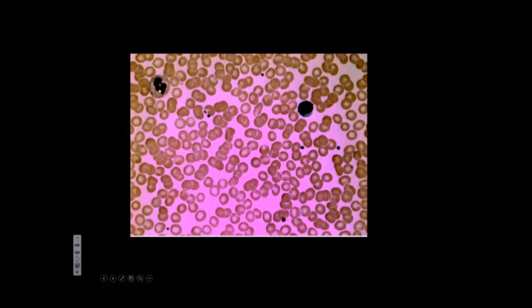Okay, I'd go with it because it's lobulated, and then this one would be a lymphocyte, neutrophil, and a, okay. This is really big, but the cytoplasm is clear, so I would lean towards a monocyte on that one, and maybe a basophil here. Two neutrophils, but then I'd second-guess myself because there's some red in the side. And if I start seeing a lot of these, I would count those as eosinophils, otherwise I'd count them as neutrophils.